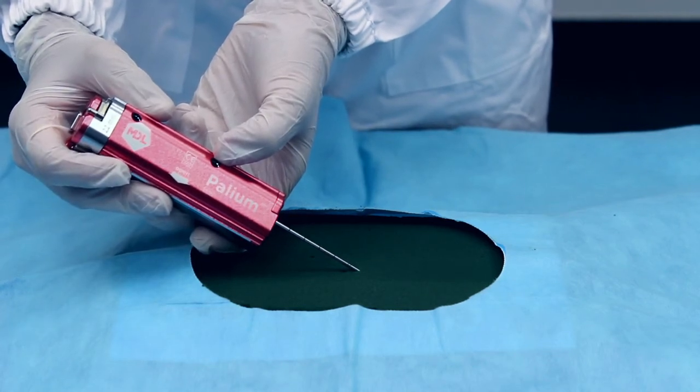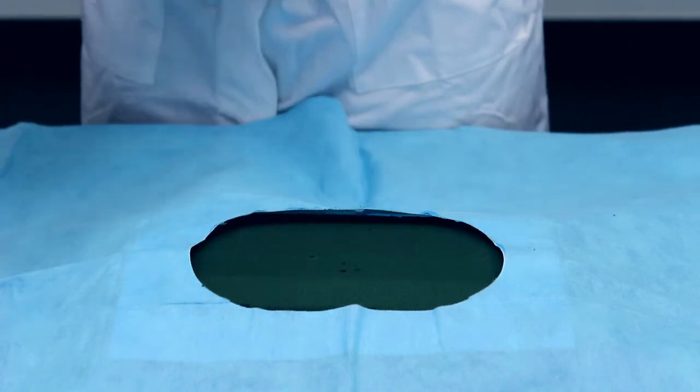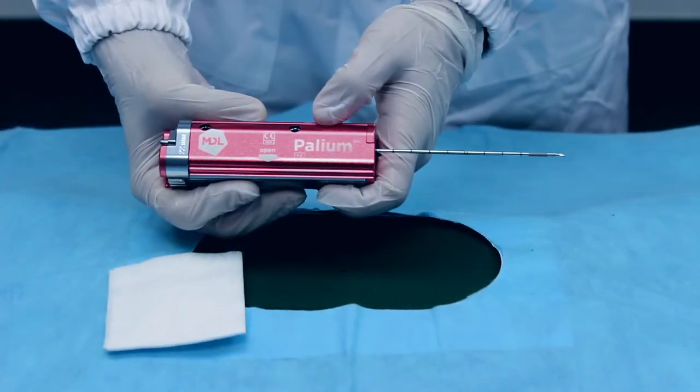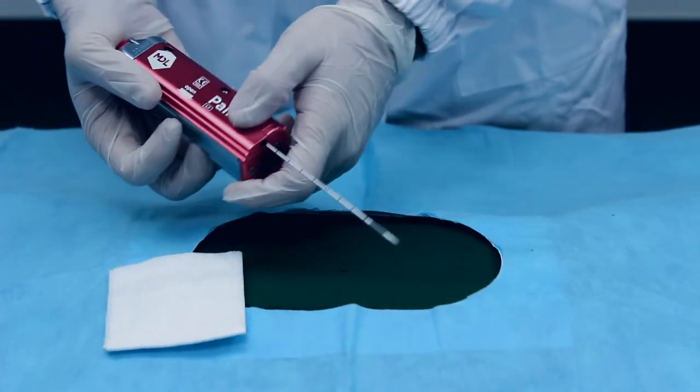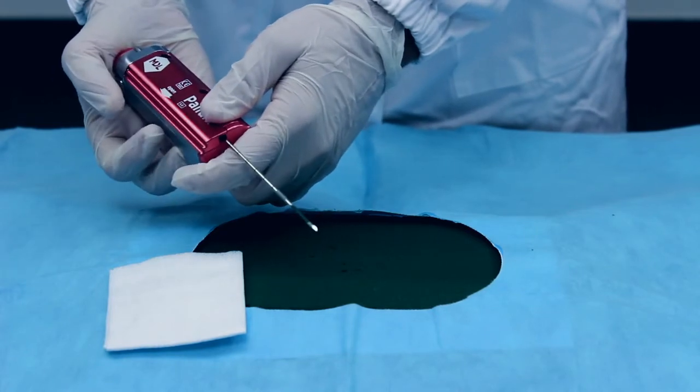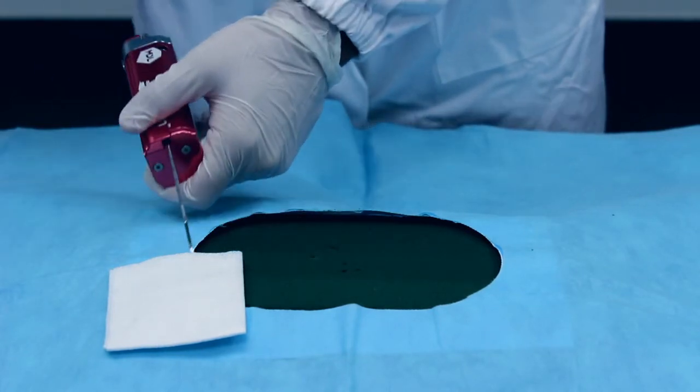Remove the device from the patient. To remove the sample from the Palium device, pull on the loading handle once in order to draw back the cannula and expose the sample.